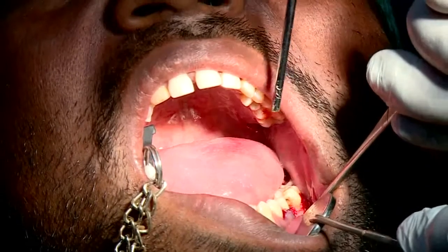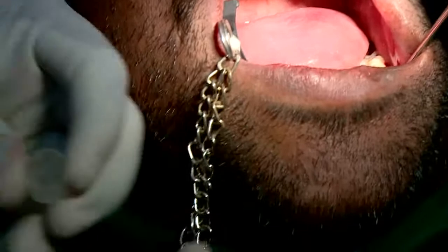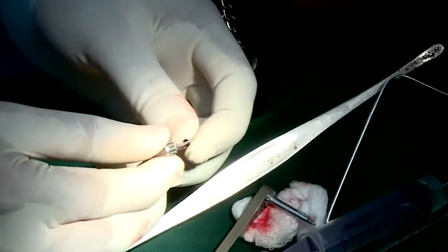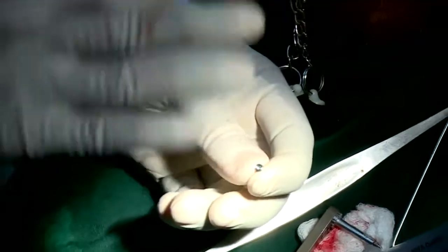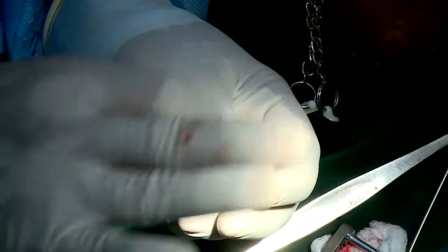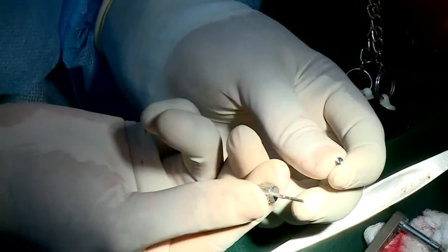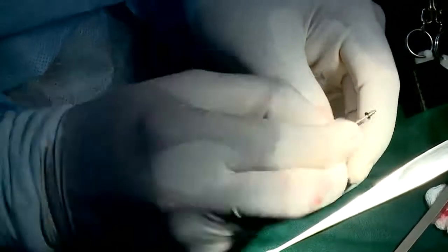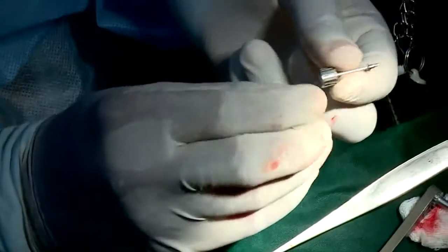Perfect. Now, sir, there are different types of drivers. This is what we call a cover screw. If you look at it, it's a very flat screw. It's just going to protect the inner aspect of the implant. And this driver is a hex driver. These are all friction fits. In other words, if you place it there, it will stay there. It will not fall off, right? And they all come with a finger grip.